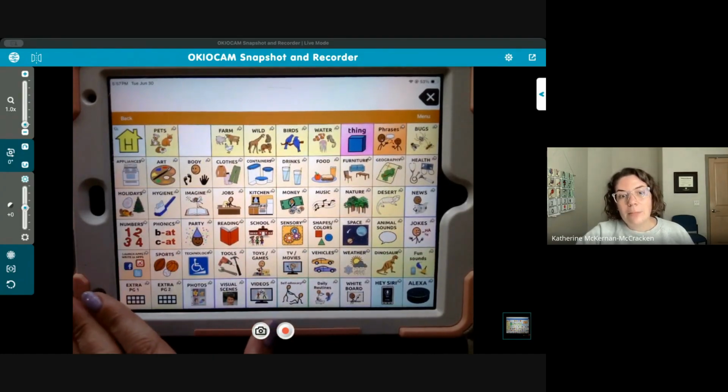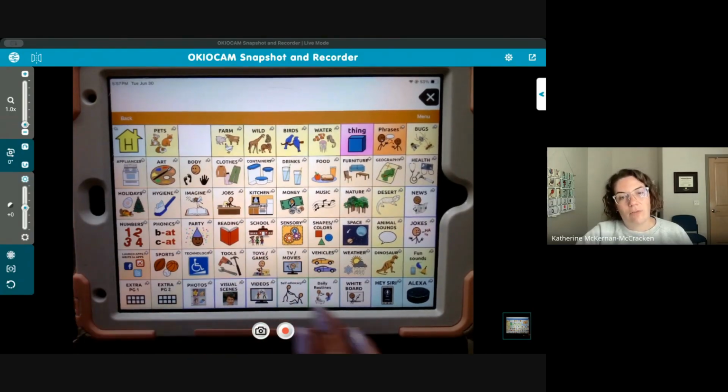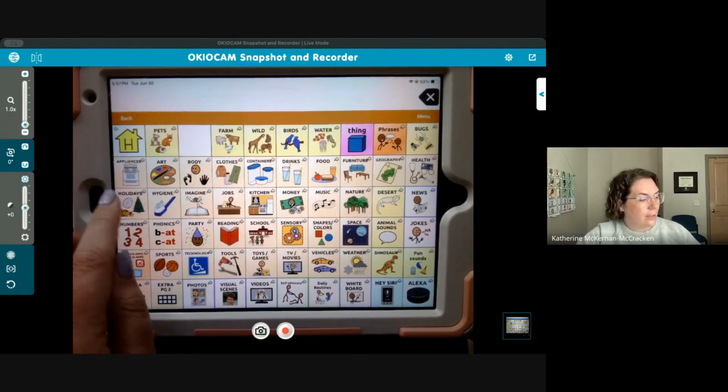Fringe words are highly specific words that make up the other 20 to 30% of the vocabulary words that we use. To make complex sentences and talk about complex topics, the AAC user needs access to both core words and fringe words. All of the apps that we're talking about offer access to both core and fringe words. That is called robust communication access.